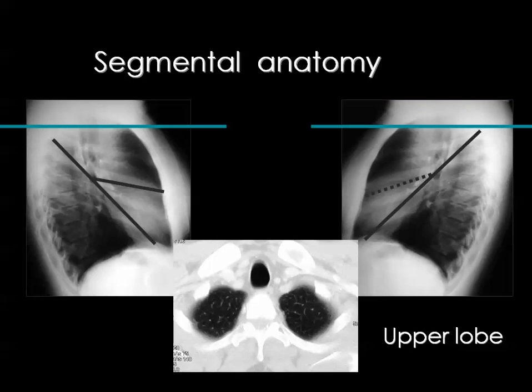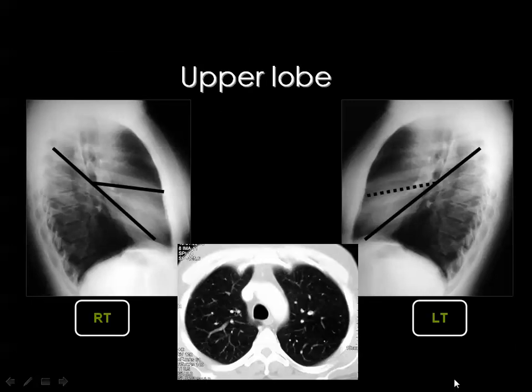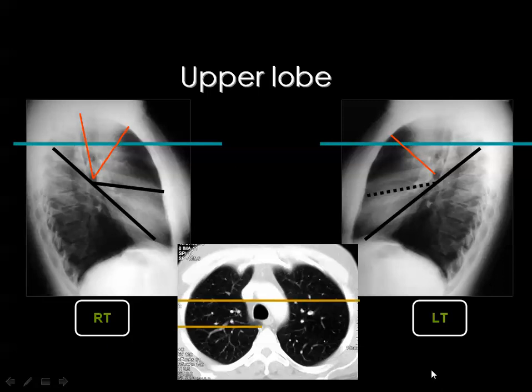For segmental anatomy: the right upper lobe has three segments — anterior, apical, and posterior. On the left side, the apical and posterior segments fuse to form the apical-posterior segment, so the left upper lobe has only two segments. On CT, two lines can be drawn: one demarcating the anterior segment region, with the posterior segment behind and the apical segment in between. On the left side, apical and posterior unite — you have an anterior segment and an apical-posterior segment.